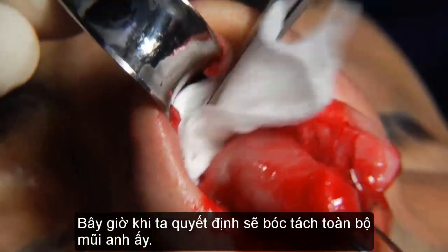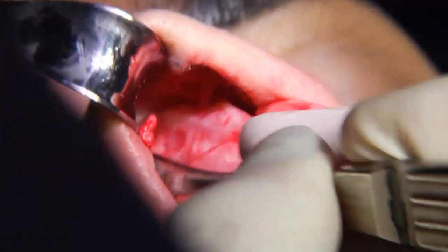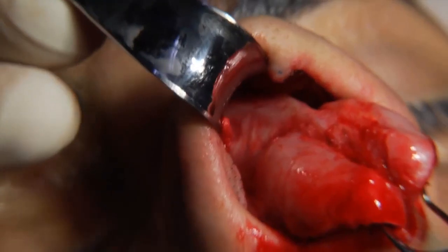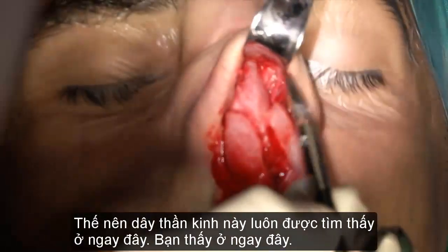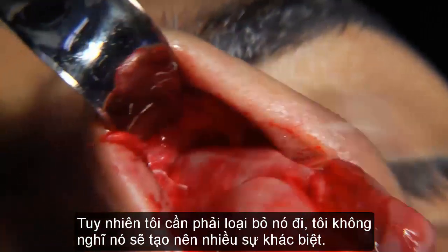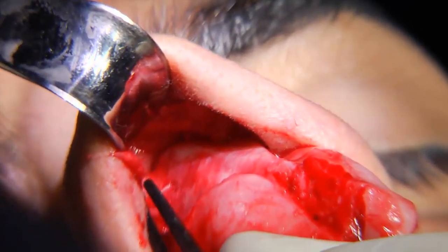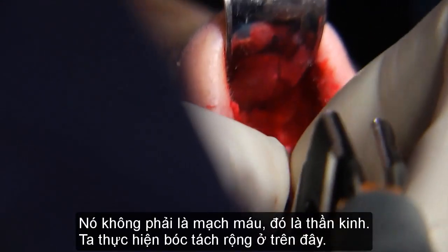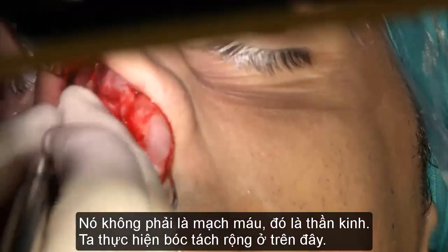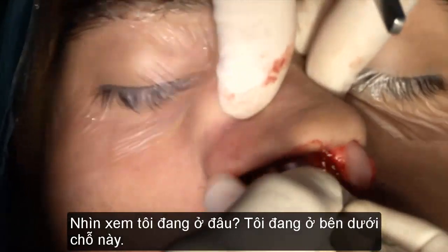Do you need anything? So now, since we decided to deglove him fully, scissors. So this nerve is a constant finding here. You see it? And you see it here. Anyway, I have to get rid of it. I don't think it makes a difference. It's not a vessel, it's a nerve. We'll do the wide degloving on him. Look where I am.